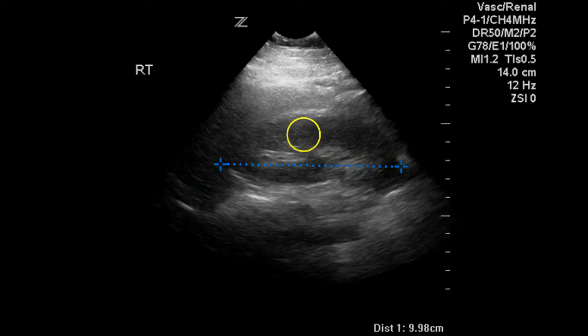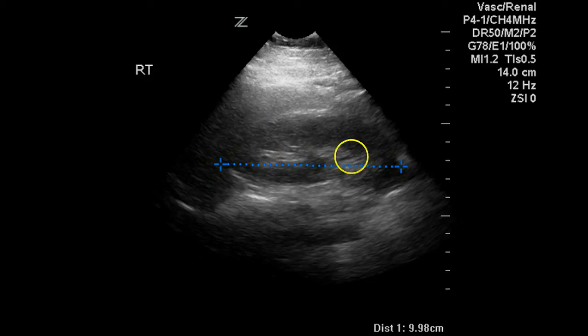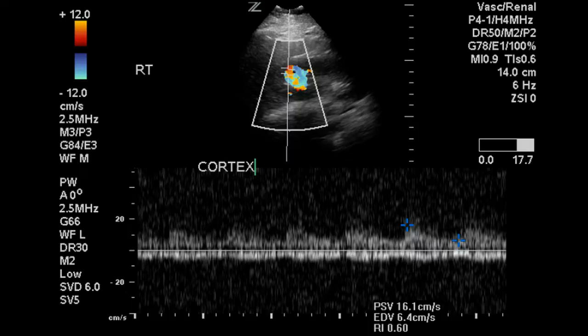The kidney is also slightly hypoechoic when compared to the liver, and the center of the kidney — the renal pelvis — is more echogenic than the liver. This is the normal relationship that we see in grayscale imaging of the kidney.